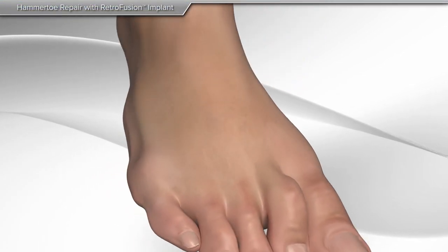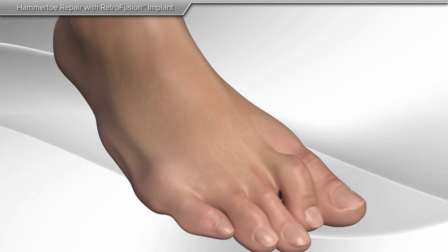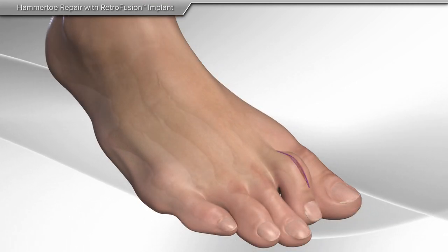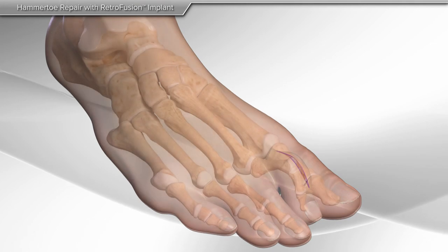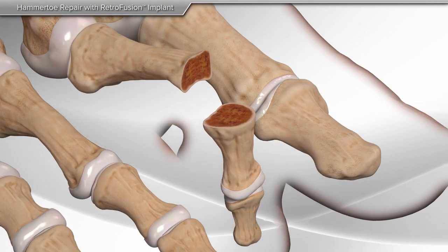The retrofusion screw technology is commonly used for the repair of a hammer toe deformity. In this technique, your surgeon will make an incision over the top of the toe. Then, your surgeon prepares both ends of the joint in order to allow for proper fusion.